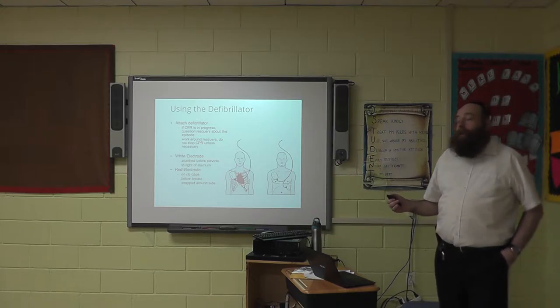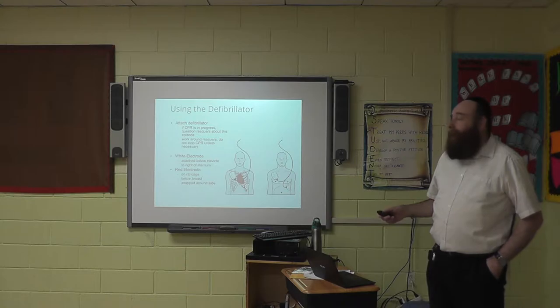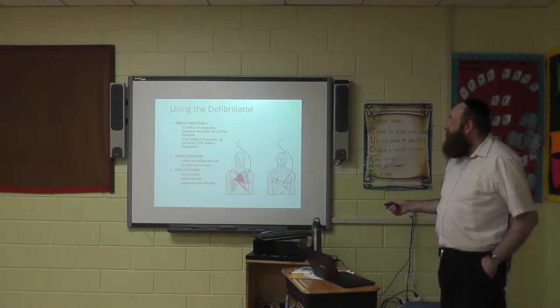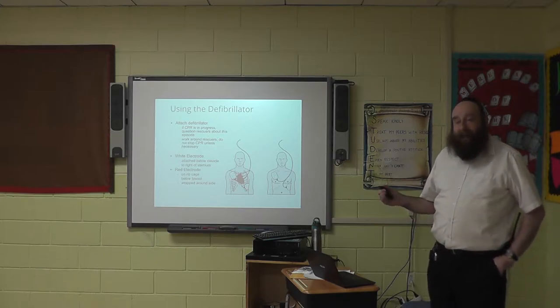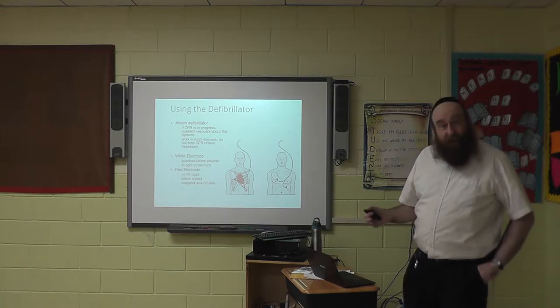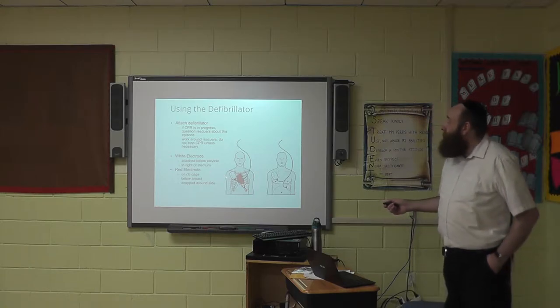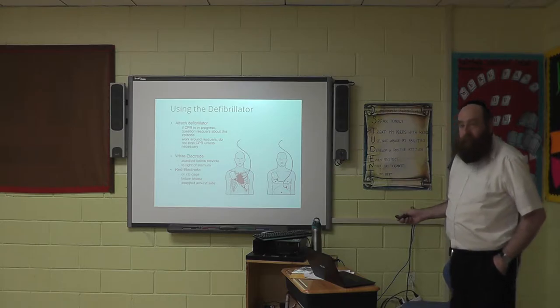There is something called Einthoven's triangle. I'm not teaching it tonight. This is lead two of the Einthoven triangle. Obviously, how many leads do you think there are? Three. Very good. That's why it's called a triangle. So this would be lead two. This is why we're placing them here.